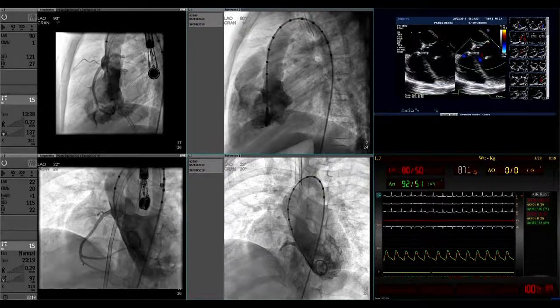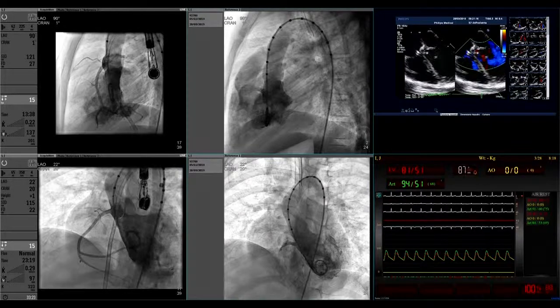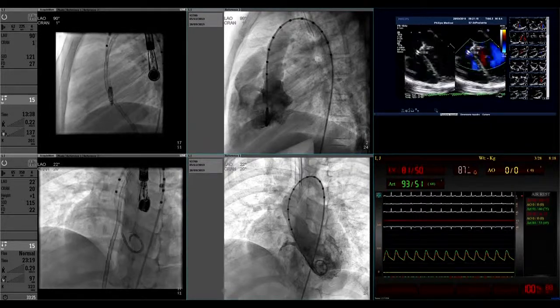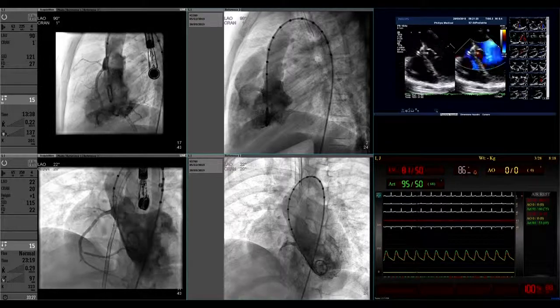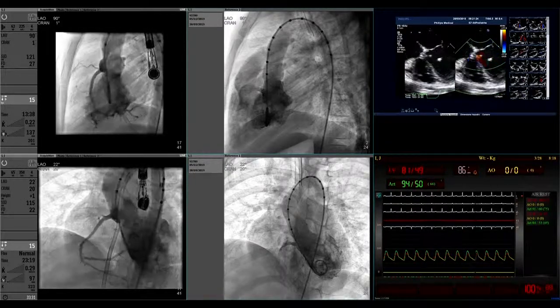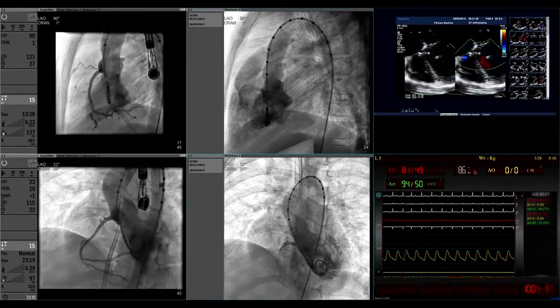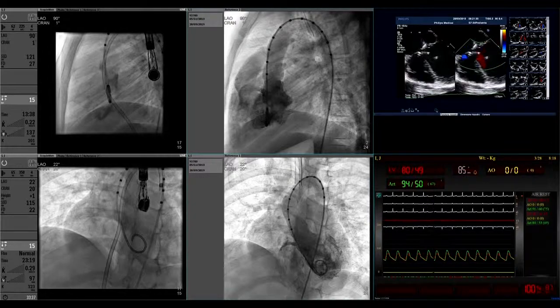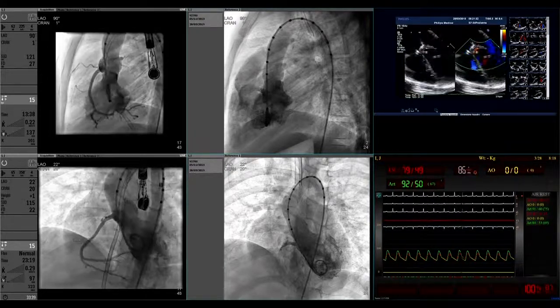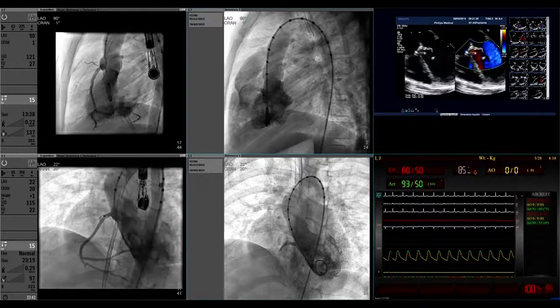Yeah, I would go with the 6.4. I'm not sure if perimembranous VSD devices are available here in Europe from LifeTech, maybe. Can anybody peep in and tell us about? Yes, Kevin. Or other devices. Because usually, that's my personal preference. I use perimembranous VSD devices for perimembranous VSD.